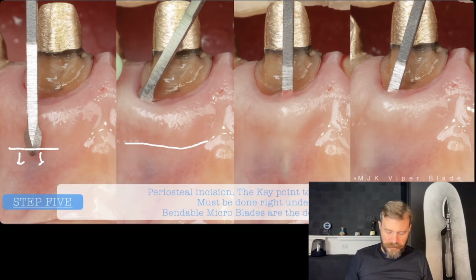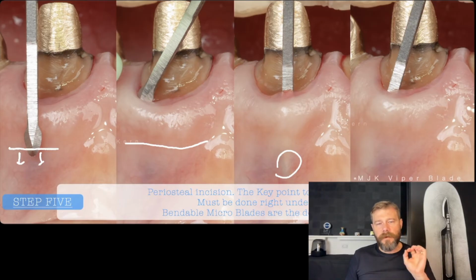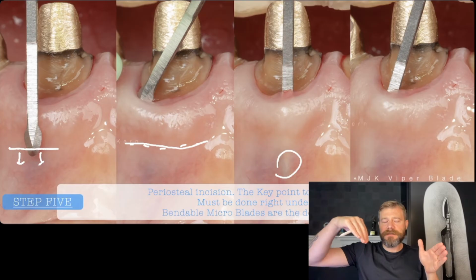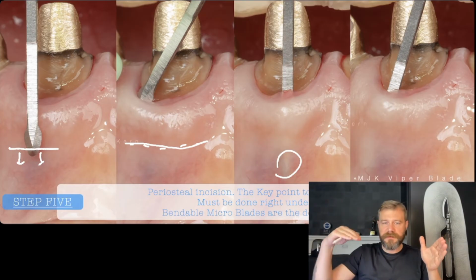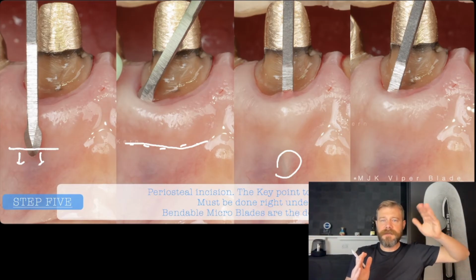Okay, so here you are seeing the instrument is splitting the tissue below, or apical to, the mucogingival line. When you have the mucogingival line here, and the blade is apical to this area, you have the mucosa there, you have the muscles, and you have the periosteum that you just cut. So it means that the blade is on the surface of the periosteum, or buccally to the periosteum, right? The periosteum is going to be kept on the ground attached to the bone. And you're going to be with this blade in the environment of the muscles, and the surface is the mucosa.